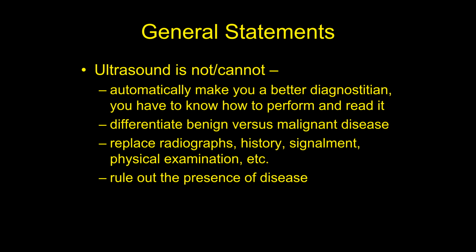Okay. Ultrasound will not differentiate benign versus malignant disease. There's no way in hell I can look at a mass inside the liver and tell you 100% for sure, is it malignant or benign? Okay. The only way to know that would be to biopsy it, get some cells out of it, something like that, and look at it under the microscope.